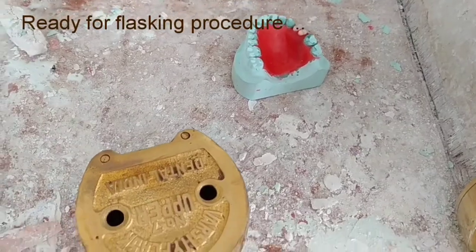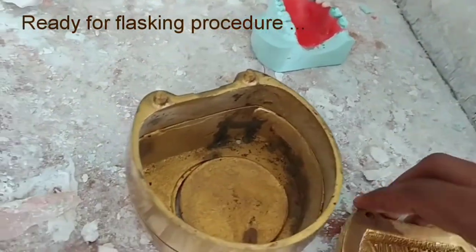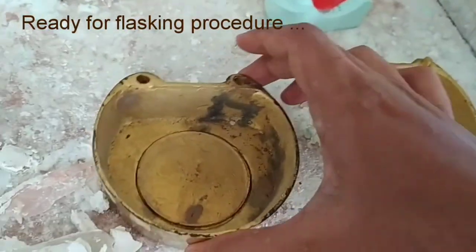Now we will begin with the flasking procedure. This is our upper flask and this is its lower unit, and we will be putting our cast in it.